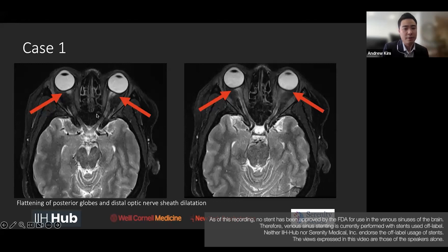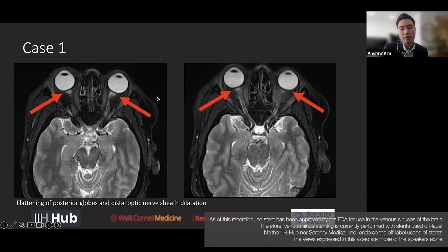You can appreciate here that there is some flattening of the bilateral globes. Instead of being the perfectly round shape of the globe, you can see where the optic nerve heads sort of insert — you can see that it's flattened. Here's another view of the same patient, just one slice off.